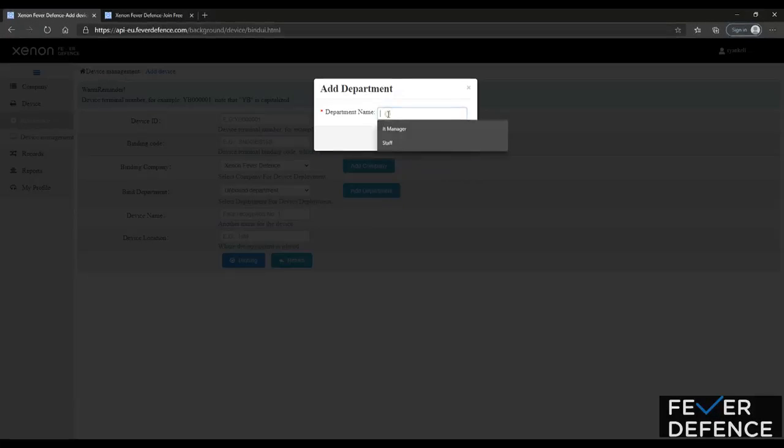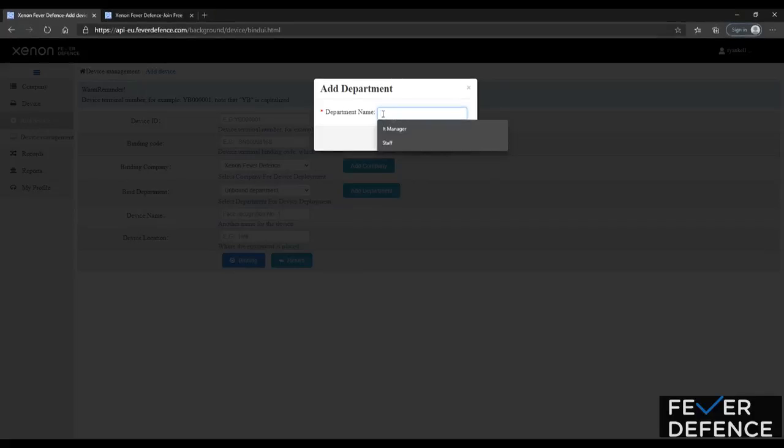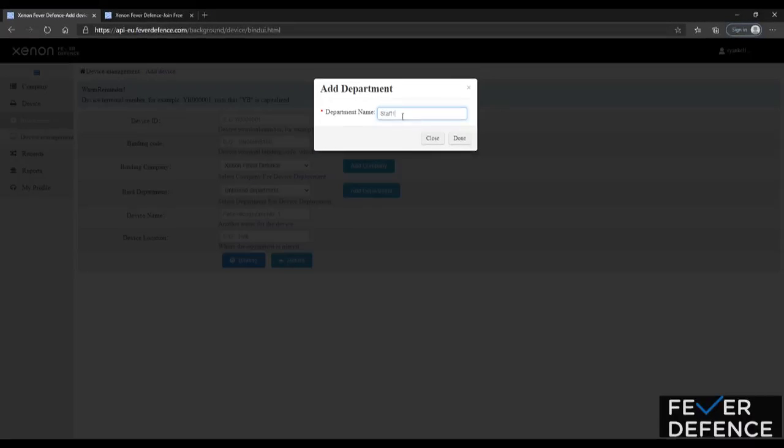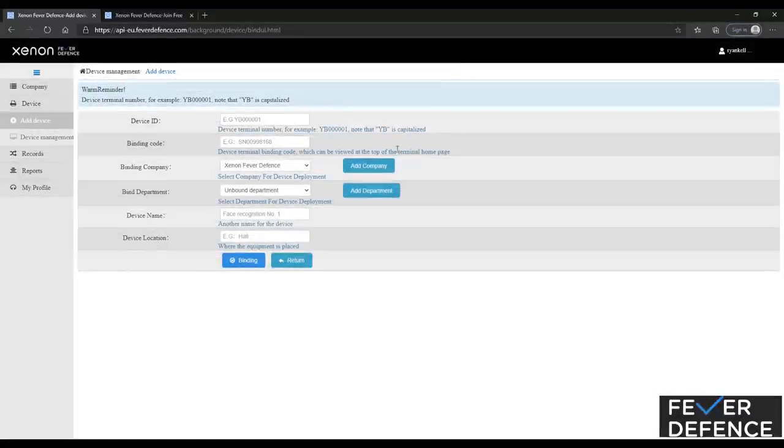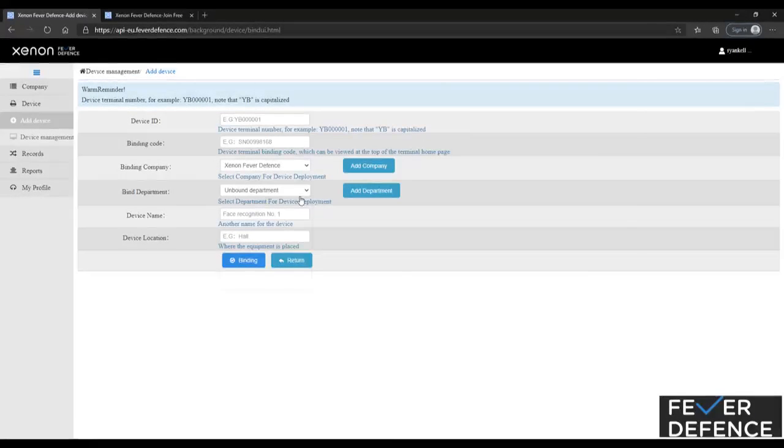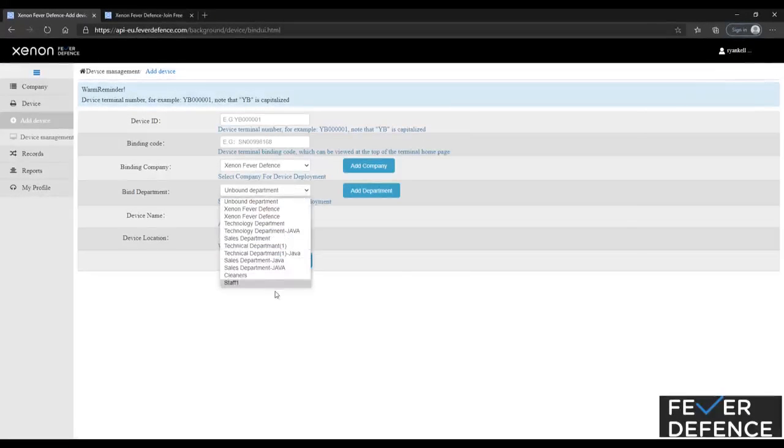So as you can see you add department, anything from staff, IT, normally staff is the one we're going to go for. So staff. Okay. So you're going to select your staff.